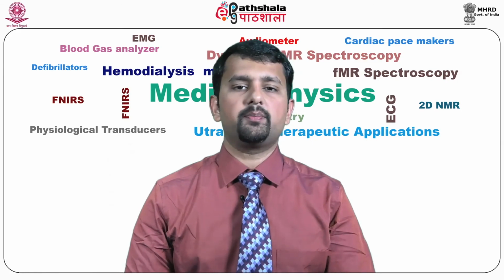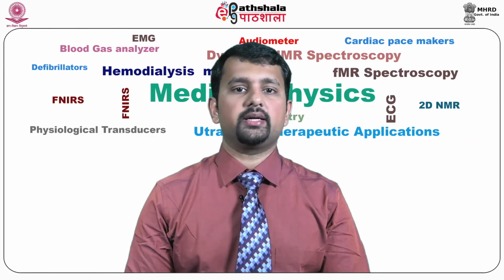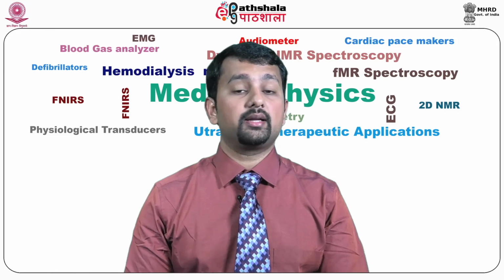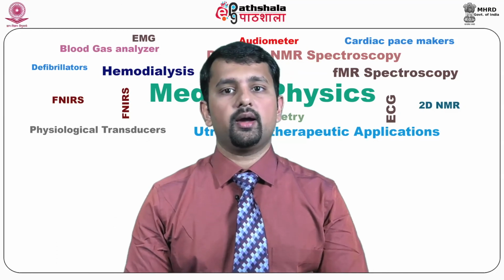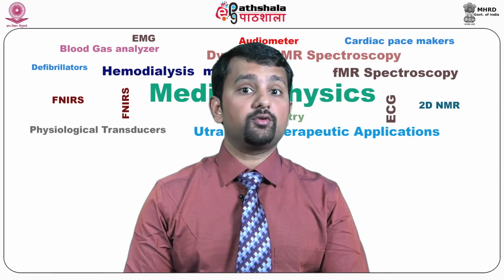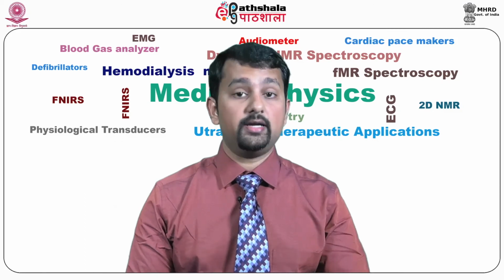Now let us discuss the pitfalls in magnetic resonance spectroscopy in clinical imaging. MRS is a challenging technique and should only be used when spectral data will provide clinical information that is not obtained by other imaging techniques. It is a supplementary technique to conventional imaging. The technique is sensitive to magnetic field inhomogeneities and requires precise manual adjustment to ensure field uniformity.